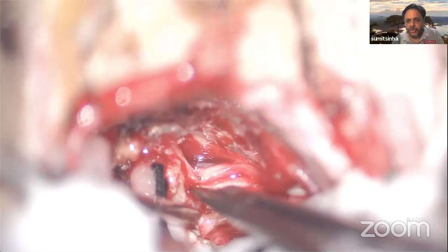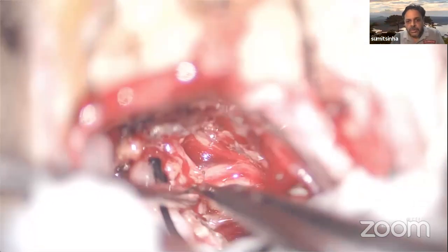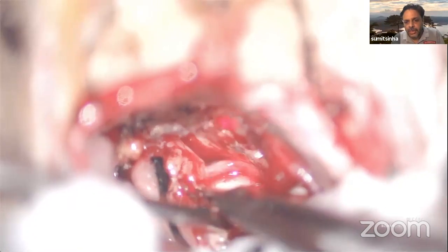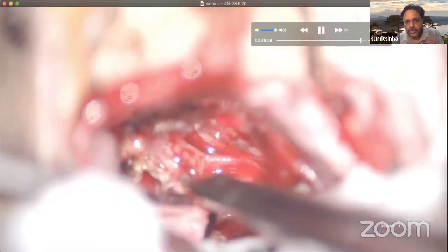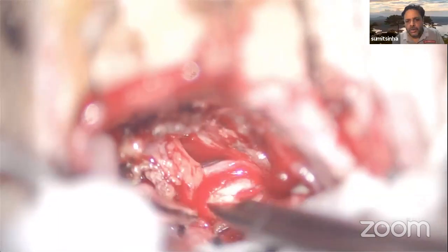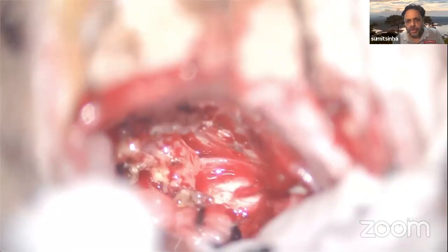And this surgery is a keyhole surgery. I always do it in high magnification, and it helps you in visualizing things properly. The keyhole surgery has to be always done in high magnification. Sharp dissection near the facial nerve, always sharp dissection again. Thinning the tumor attached to the facial nerve as much as possible without damaging the facial nerve. This is the crux to finding a beautiful outcome of facial nerve preservation after surgery.